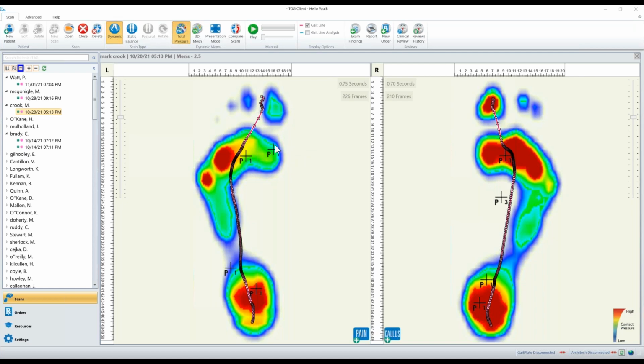So to test the first MTP joint, put the patient into the chair, hold the foot in some semblance of subtalar neutral. Just put your thumb medially underneath the medial calcaneum, stop the talus sliding, and bend the big toe. And if it bends past 50, 60 degrees, you're going to be good. So in this case, there's good range of movement.